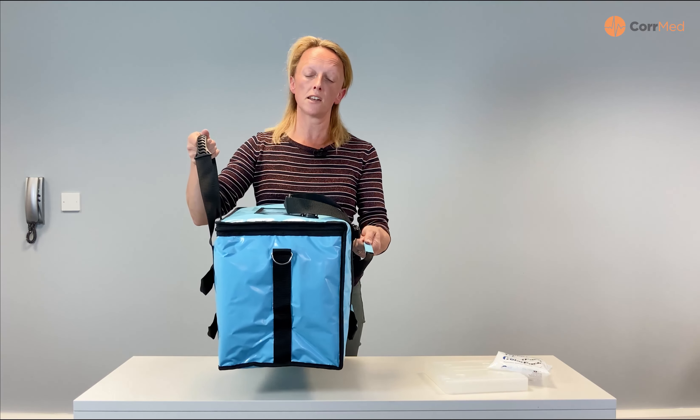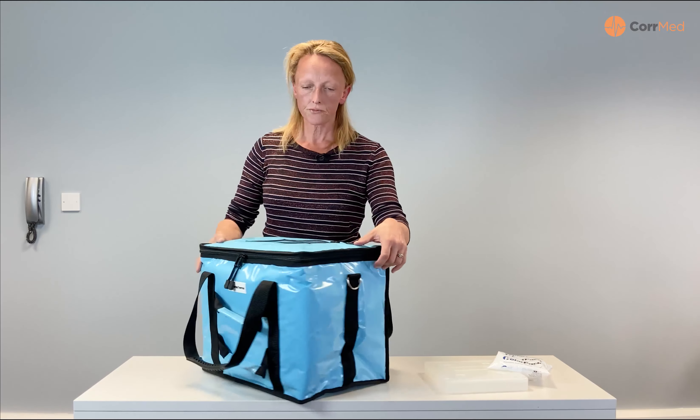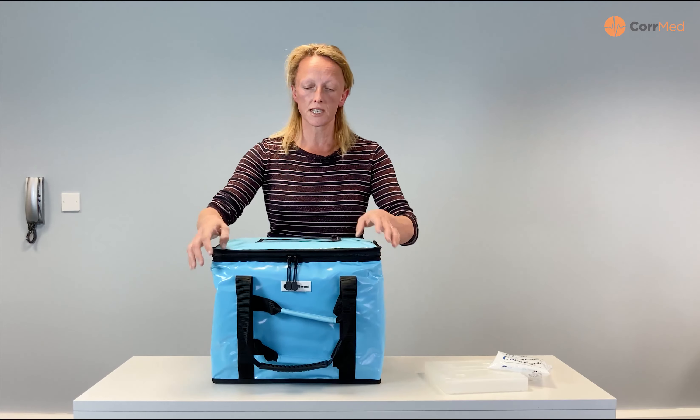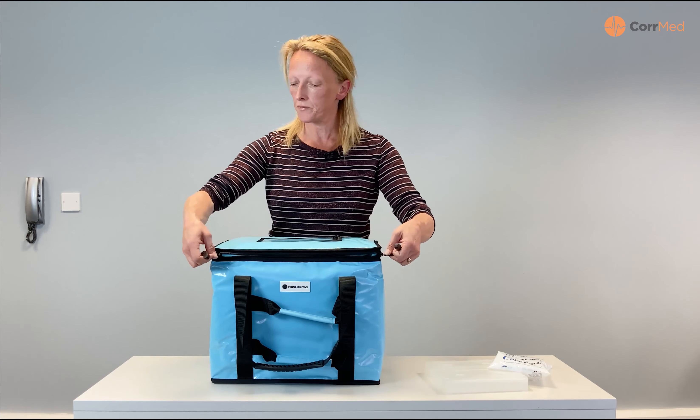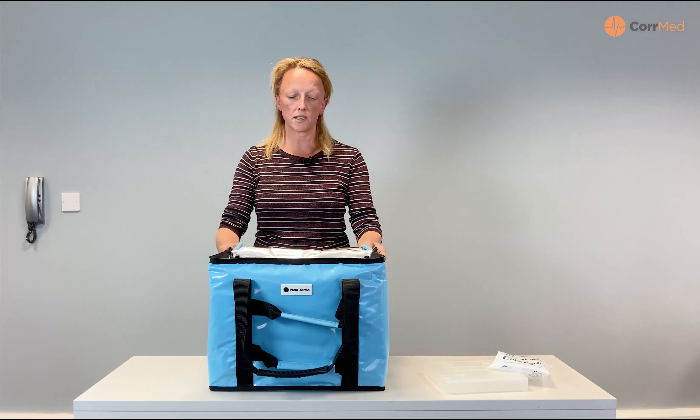These bags have been designed to integrate onto an aluminium trolley with clips to hold it in place. These are clips as opposed to Velcro or anything like that, because we want to maintain our infection control properties at all times.